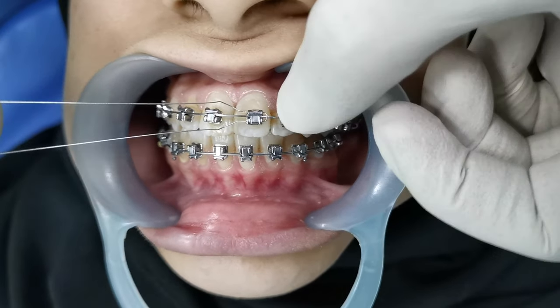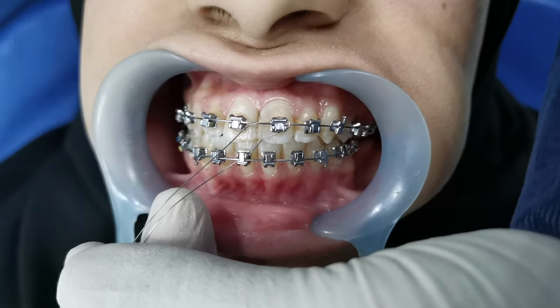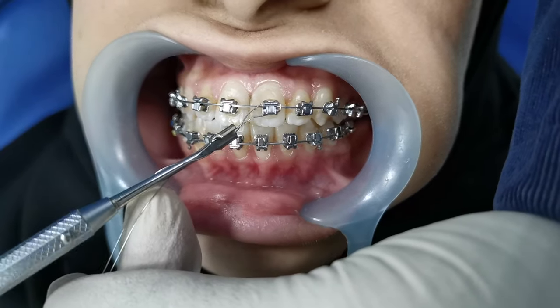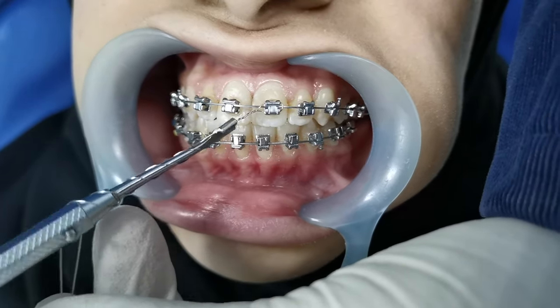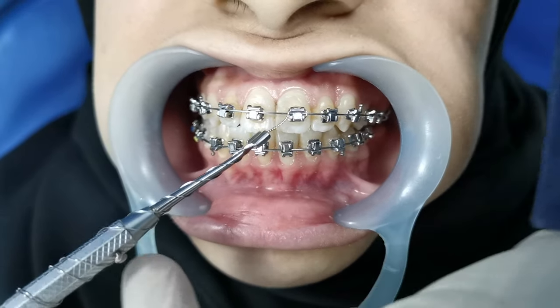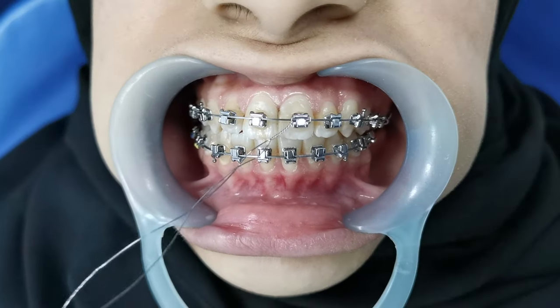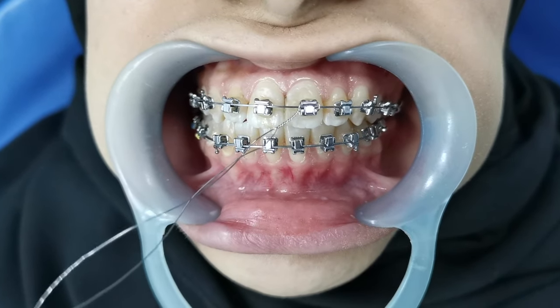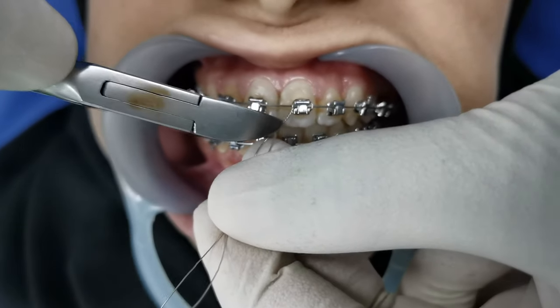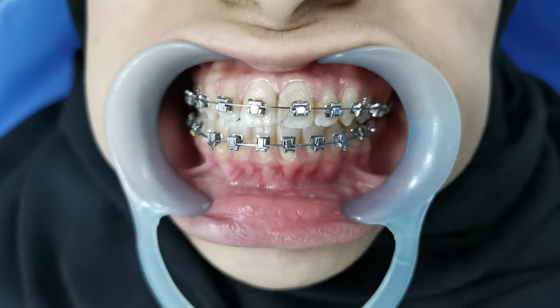You can adjust by using your finger. Hold both wires in this manner and using the twister, twist in this fashion — twist until it comes to the end of the bracket. By pulling out the twister, you need a ligature wire cutter to cut it. Cut the twist part 1.5 to 2 millimeters.